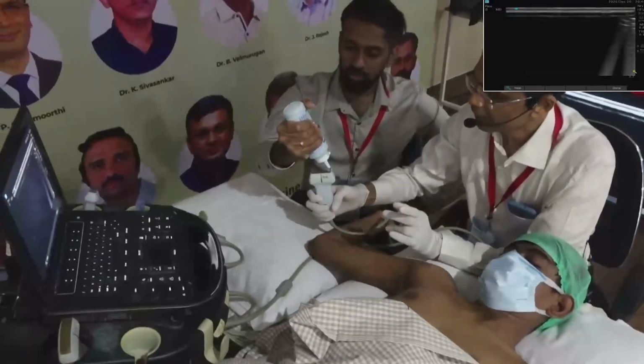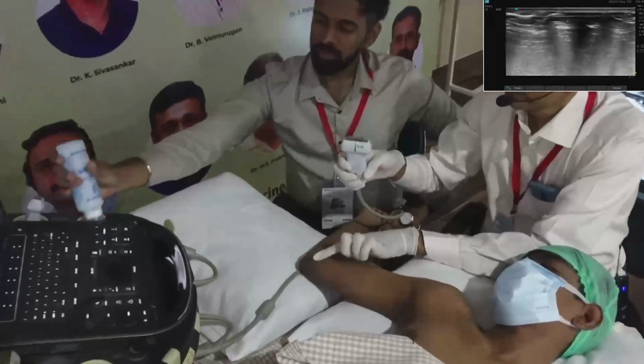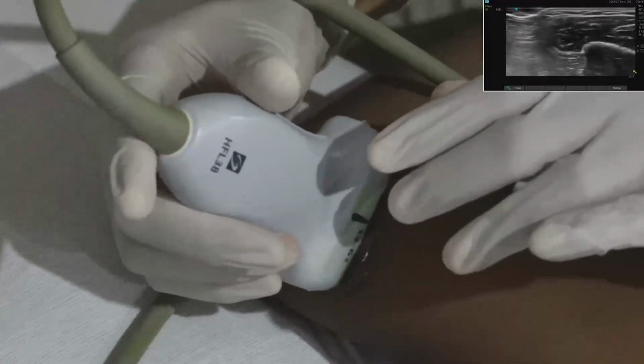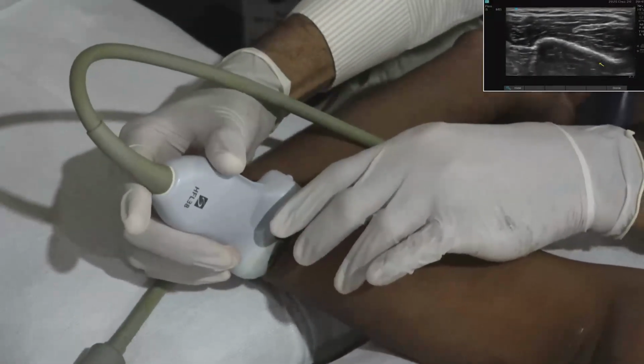So everyone, we are all aware that next to the medial epicondyle, this is the medial epicondyle, here next to that we have the ulnar nerve. Even for a very obese patient, we can palpate and identify it. So this is the medial epicondyle, that bony shadow.